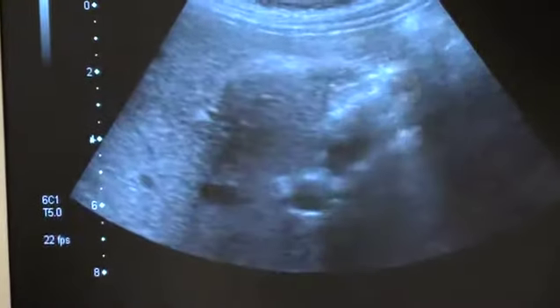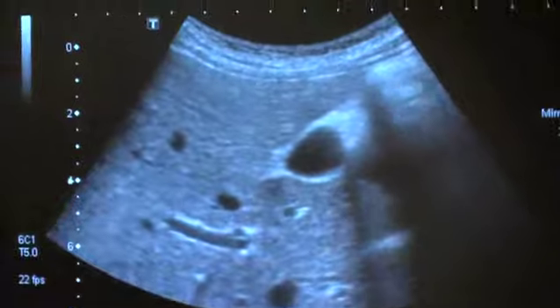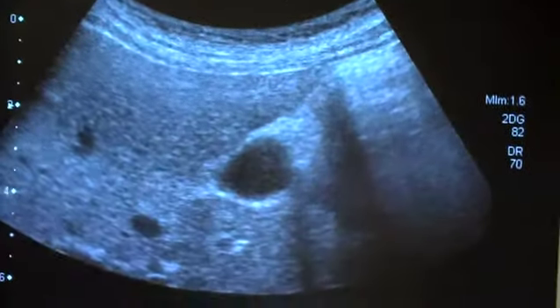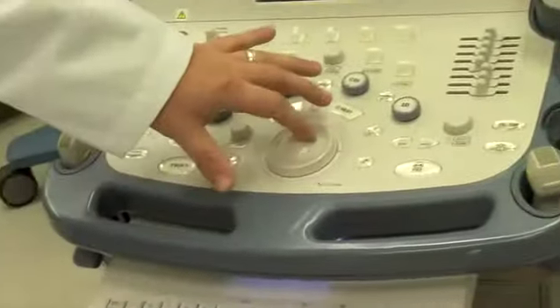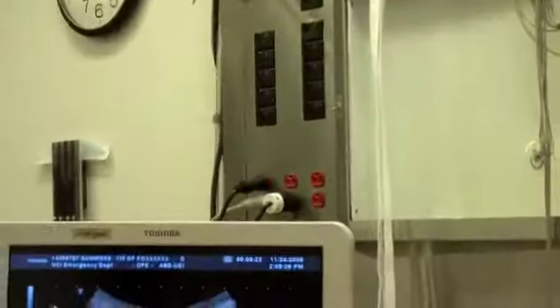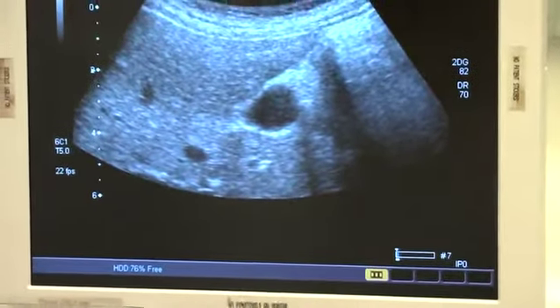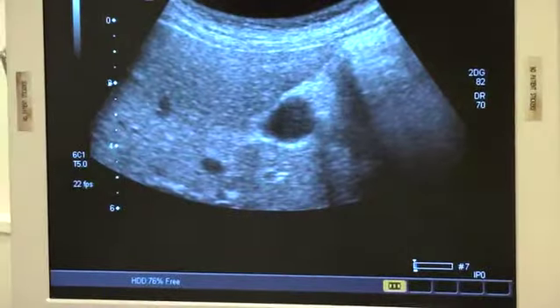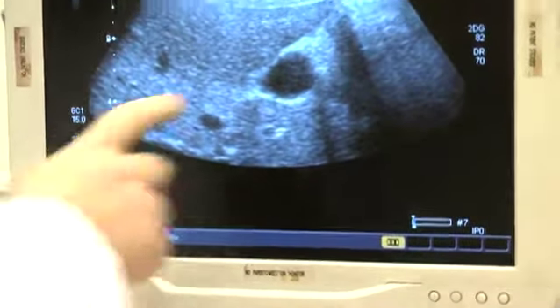I'm going to change my depth a little bit, and then I'm going to freeze it. Oh, now I lost my picture, so I'm going to go back with the trackball on freeze, and it'll go back to where I was before, so I can get a good view to measure the wall. I'm going to show you guys how to measure the wall of the gallbladder in transverse axis. It's always best to measure the anterior wall of the gallbladder, the one closest to the probe. You're going to go to caliper.